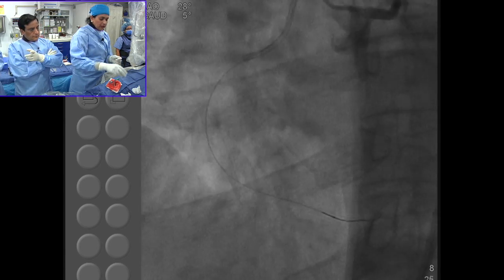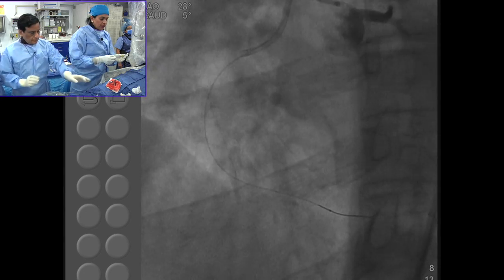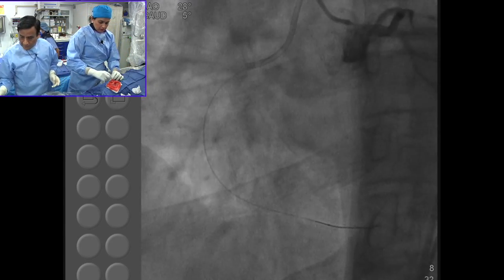You take care of the lesion, which is a CTO, and then you give vasodilation, and then if you need it, you could have just later on done a balloon. If needed, then only you stent. A little balloon. We are 2.5, 12 compliant balloon.